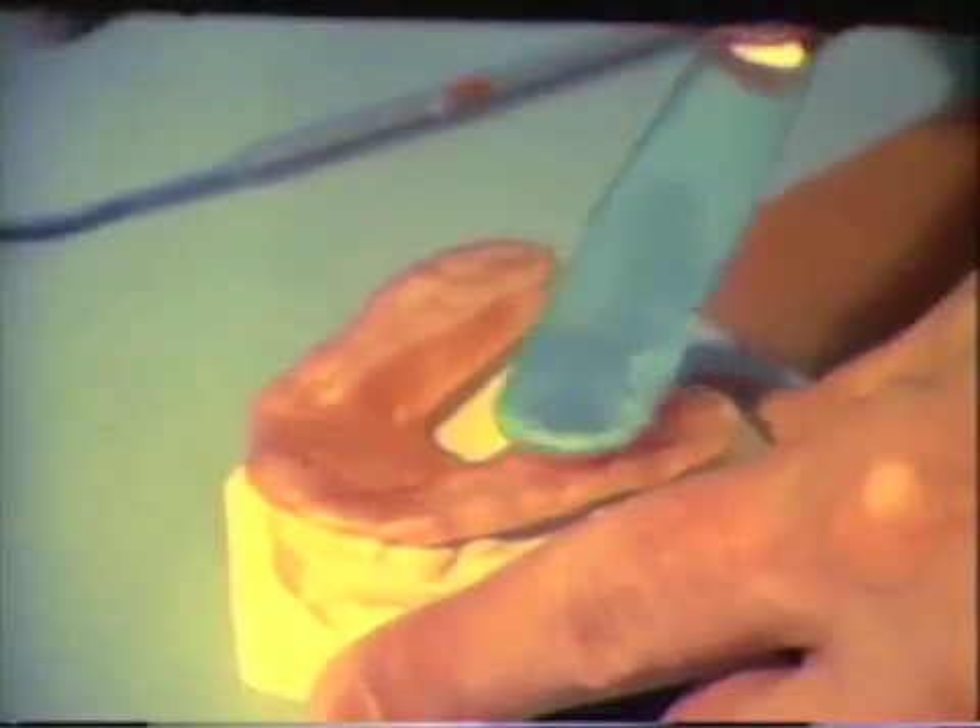Observe the occlusal markings on the wax. With a warmed spatula, the occlusal surfaces of the wax are trimmed in the posterior areas. The wax is removed to the bottom of the imprints.